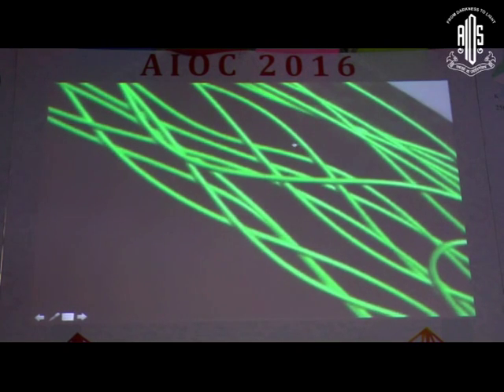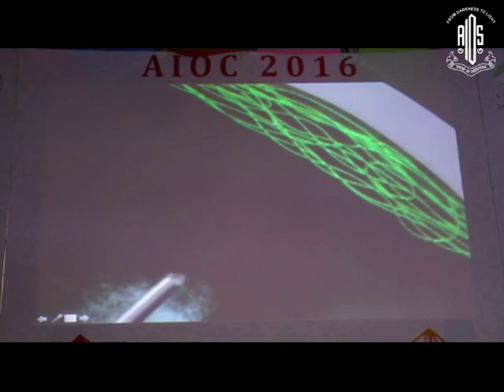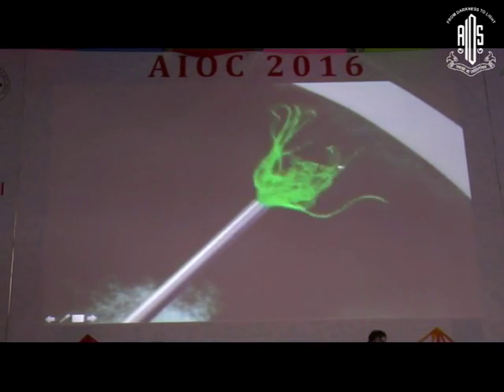So imagine the green is the cohesive viscoelastic and this is the endothelium. And it has been applied in the antechamber. Now when you try to aspirate or whenever there is any movement occurs, this viscoelastic which is cohesive moves en masse, and that's why it does not remain long in the chamber.